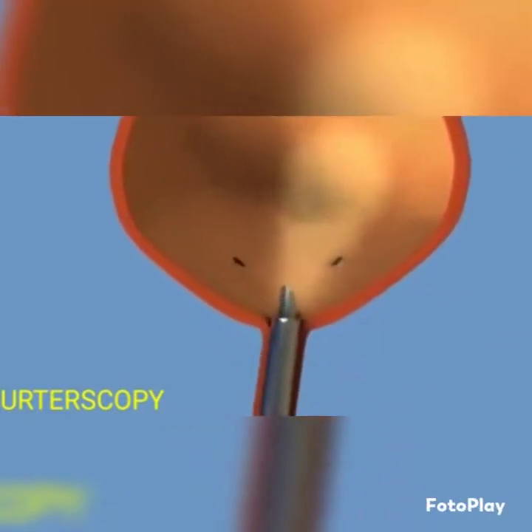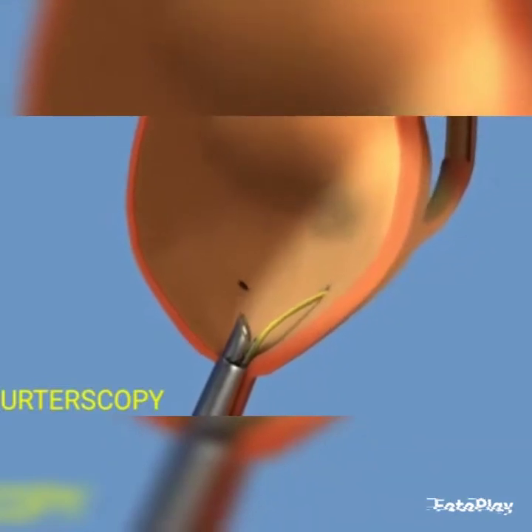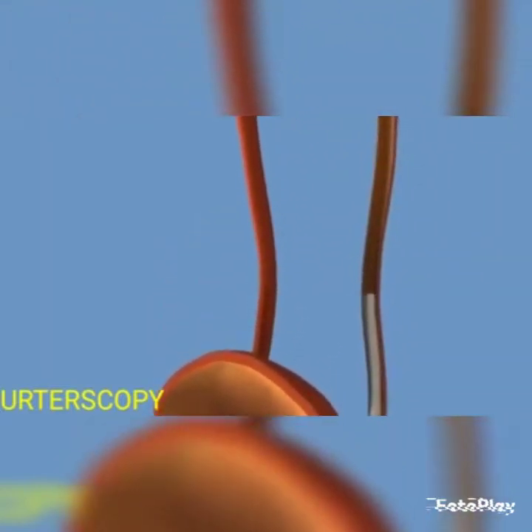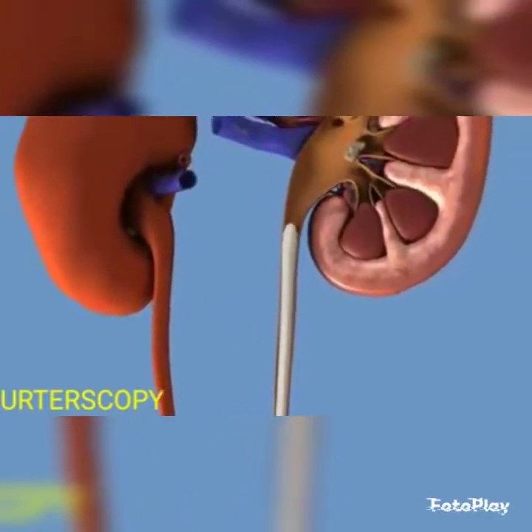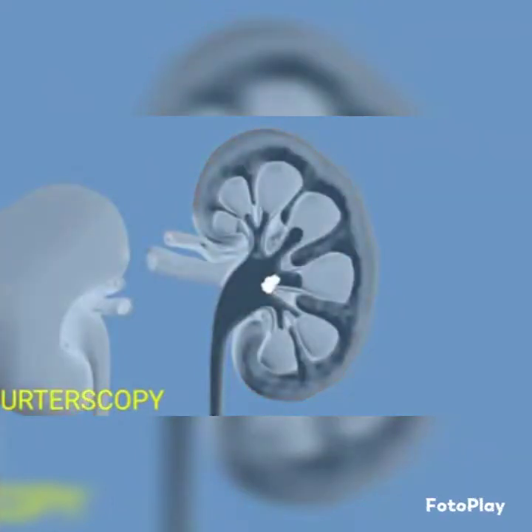A small tube is passed through the urethra into the bladder, and from there up into the ureter and into the kidney. A contrast study may be performed to assess the anatomy of the renal collecting system before stone removal. A contrast agent, or dye, is administered through the tube into the ureters. X-ray images clearly outline the urinary channel and exact position of the stone.